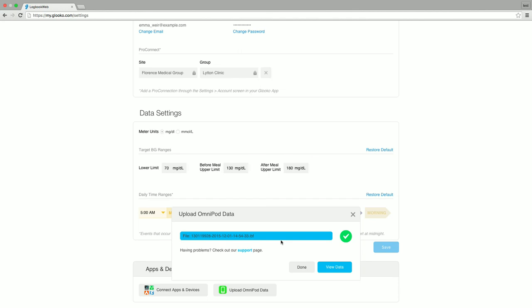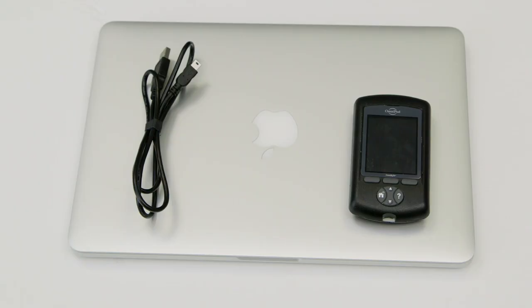Perfect! You've learned how to sync an Insulet Omnipod PDM with the MyGluco web uploader. Happy syncing!